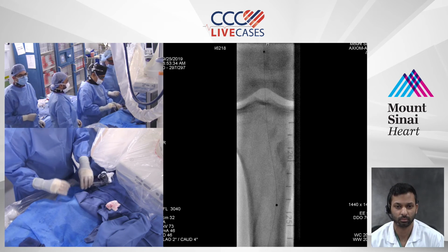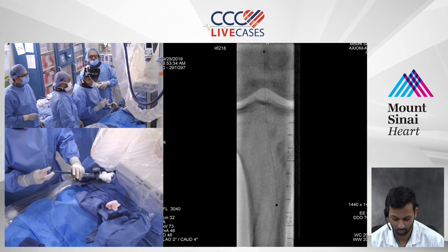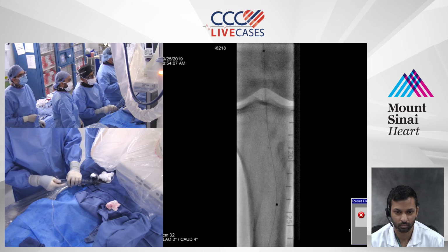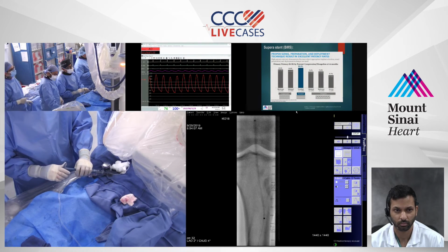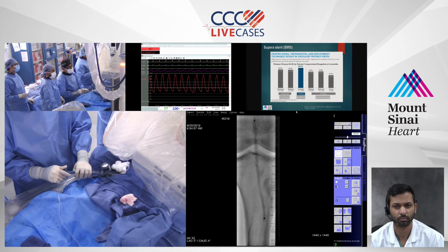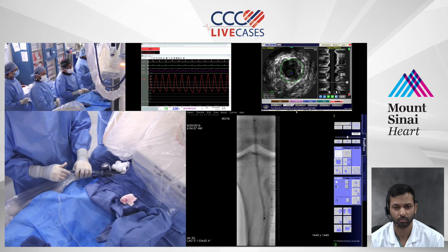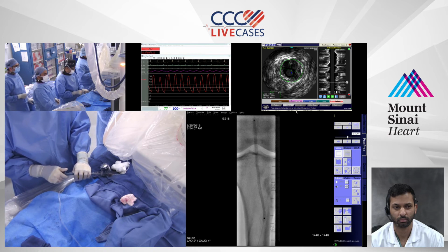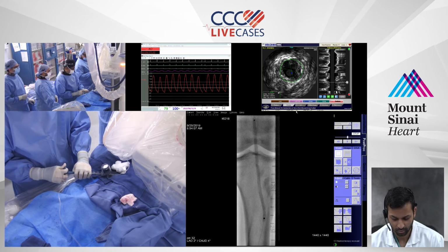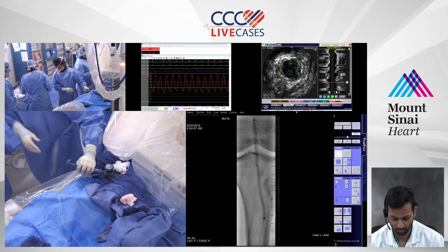And I think that I'm not burning a bridge if I do a DCB, for a couple of reasons. I don't think you would have bypassed this occluded vessel anyway. I've not gone too far down. I've not knocked off the collateral as of yet. Things may change after this. And I think that overall his patency may be improved. At least with IMPACT, we know that the patencies do improve in complex lesions. So we're going very slowly with a 4.0 DCB. And what you said, 4 atmospheres. What's nominal? 8. Go slowly to 8, please.